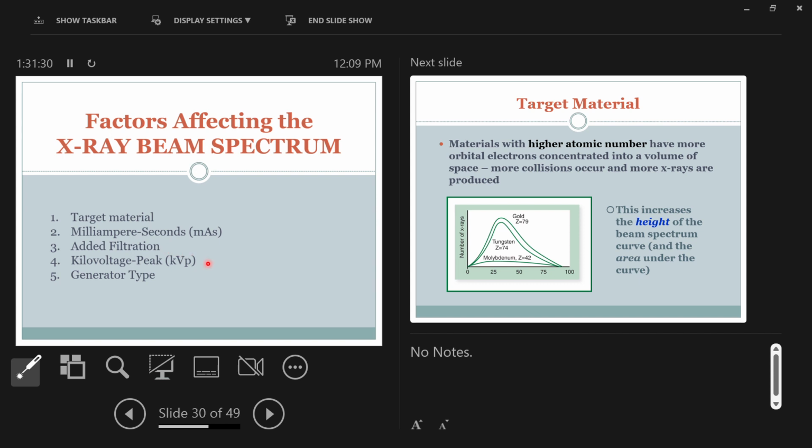Again, the best analogy that I like for that is cloudy day, overcast day versus sunny day, right? Understanding that the light you receive changes. KVP literally just is controlling the energy of the X-ray beam. It's your, assuming everything else stays the same, right?